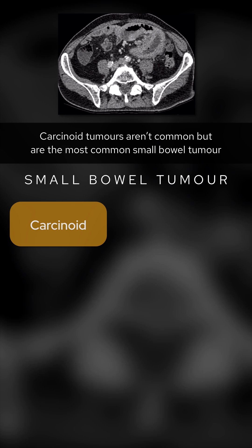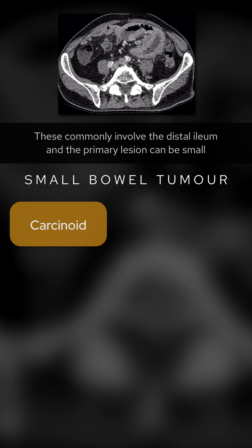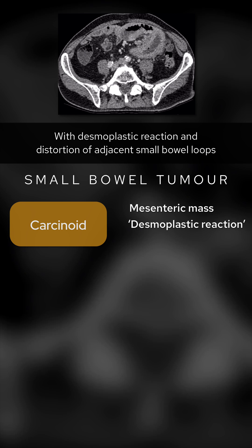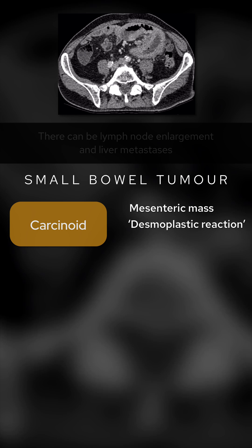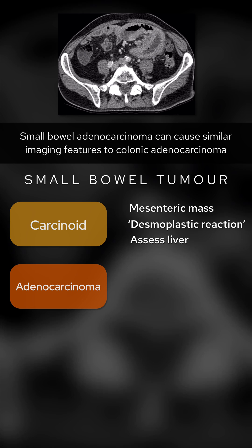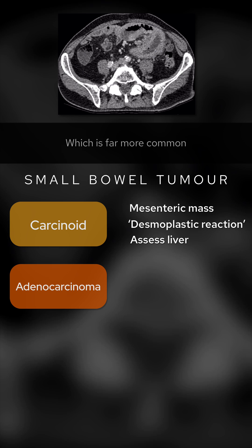But what small bowel tumours are there? Carcinoid tumours aren't common, but are the most common small bowel tumour. These commonly involve the distal ileum, and the primary lesion can be small. They can present on imaging with a larger mesenteric mass, with desmoplastic reaction and distortion of adjacent small bowel loops. There can be lymph node enlargement and liver metastases. Small bowel adenocarcinoma can cause similar imaging features to colonic adenocarcinoma, which is far more common.